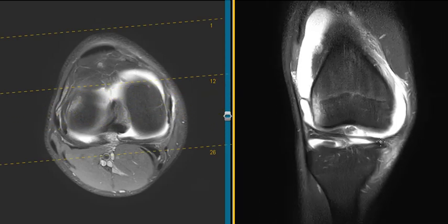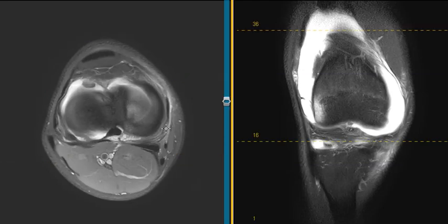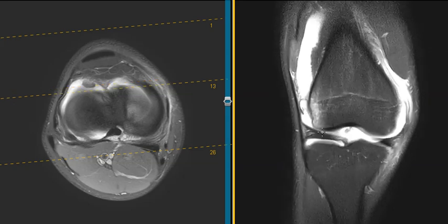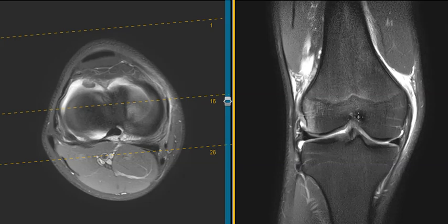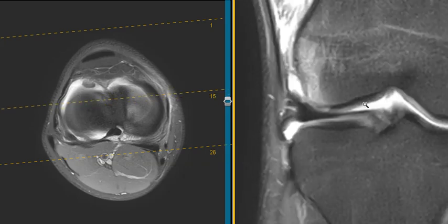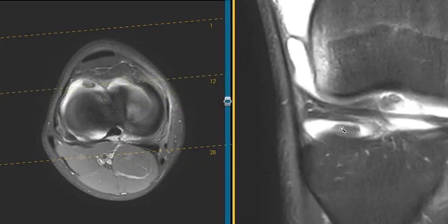So we're going to go to another view to check this out. On this view, looking in the front, we do see this little fragment here — a little well-defined dark band surrounded by fluid. This is a little defect, and it's so well-defined and clean it does look like a chondral fragment. Going up to the articular surface — this is the femur, the medial condyle, the lateral condyle — this is that marrow edema. Most of it's above the articular surface, but as we come down, this is the articular surface. Zooming in, we can see on this view a dark band here. This is the cartilage overlying the articular surface, and right here it becomes bright. There's a little defect involving the articular cartilage and possibly the subchondral cortex, with marrow edema. So that little fragment tore off and went towards the front.